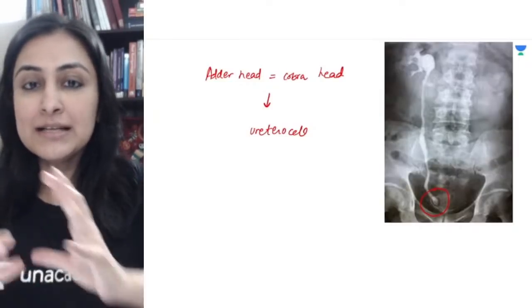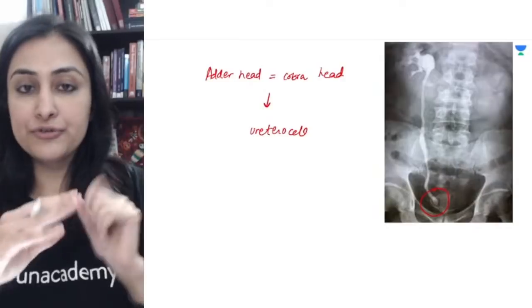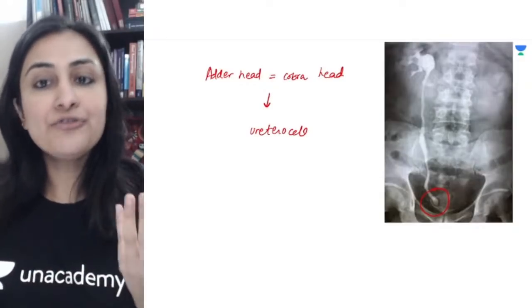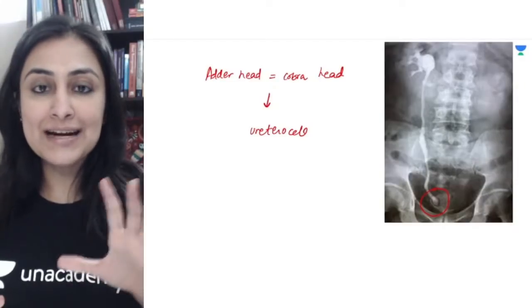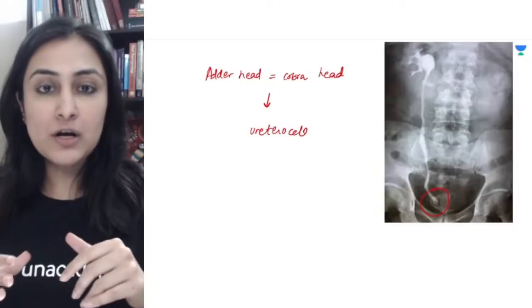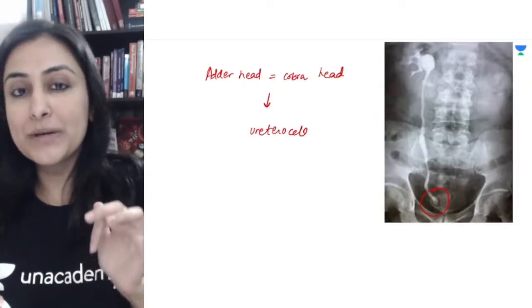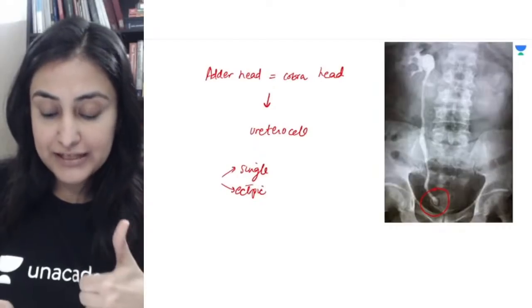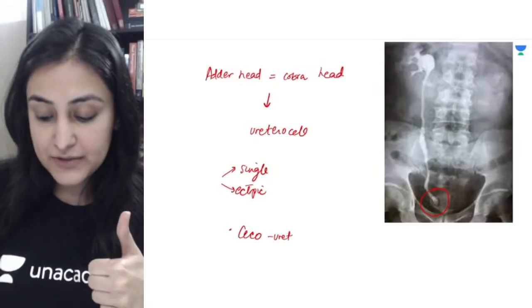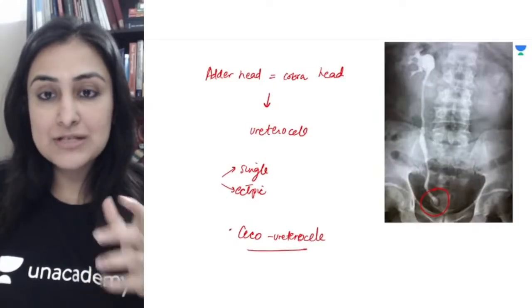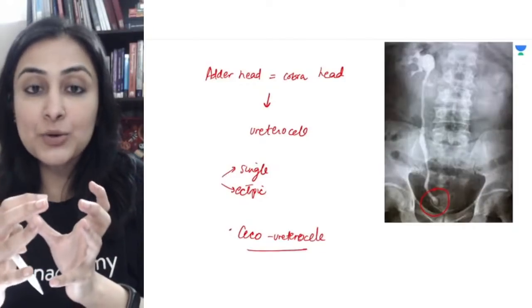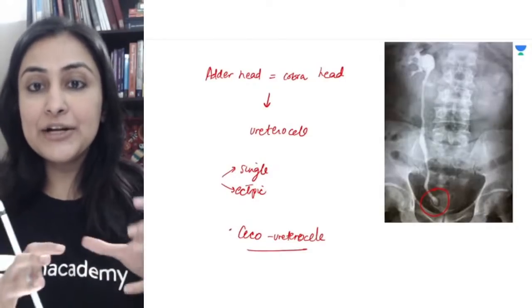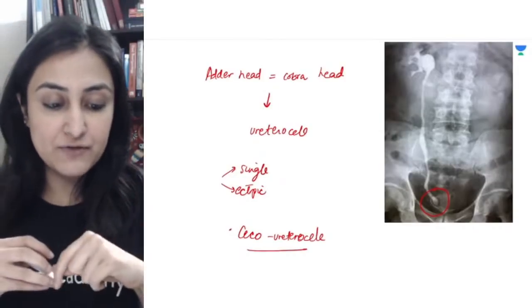Adder head or cobra head appearance represents ureterocele. There are mainly two types: one is a simple ureterocele in the orthotopic location where you have a cystic dilatation, and the other is an ectopic ureterocele which is usually associated with a duplex moiety. A rarer variant is cecoureterocele, where the entire cystic dilatation prolapses further down into the bladder neck and into the urethra.